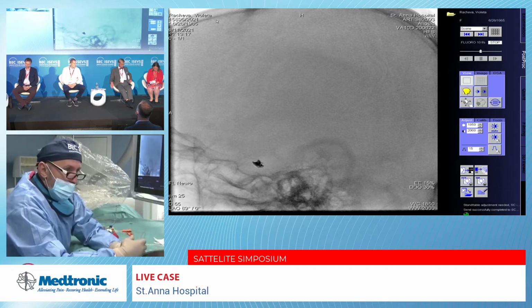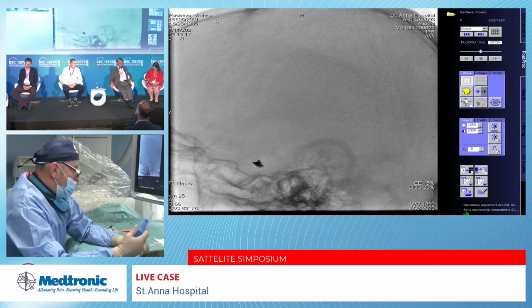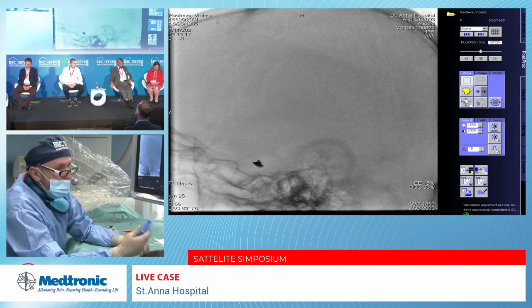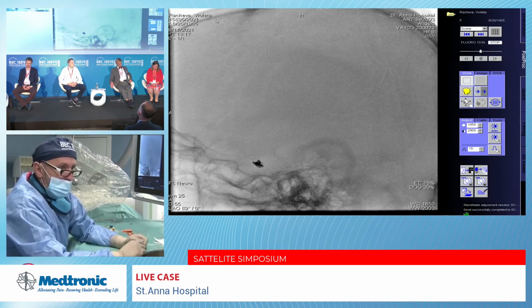I will comment about the stent stenosis. Regularly, I put the patient on statins for a couple of months, and I think that it's okay. A patient who is older than, for example, 55 years, I put on a statin, with the statin at home. I see.